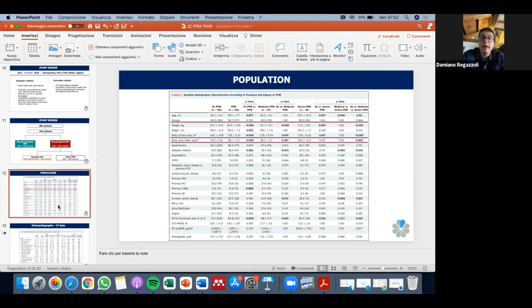Obviously, you will end up with higher risk of paravalvular regurgitation because you're not using Sapien, and higher risk of permanent pacemaker. But oversize is not related, or is not directly related to permanent pacemaker implantation, and with a higher risk of difficult reaccess to coronary arteries.